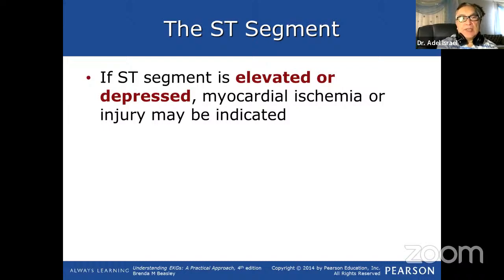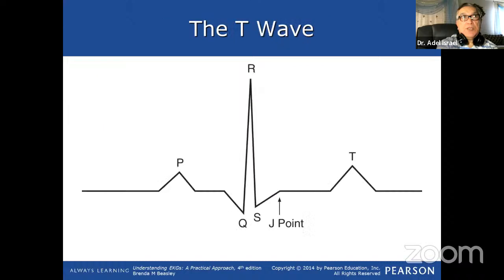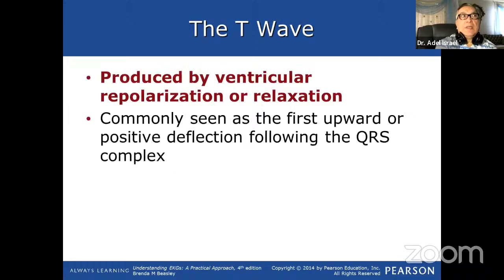And this is very important, as I told you, when we have a patient in the emergency room and we find that the ST segment is elevated, we have to admit them into the intensive care unit for heart attack, okay? Like we mentioned, the T wave represents repolarization of the ventricle or relaxation of the ventricle, and it should be positive all the time. If it is inverted, it also means that an infarction has happened to the ventricle.